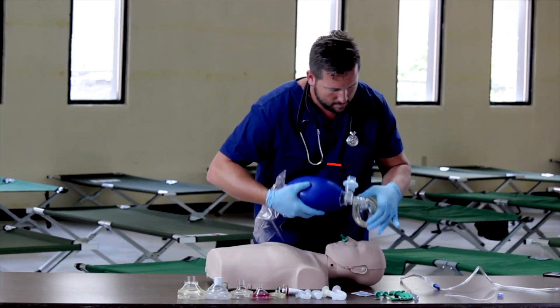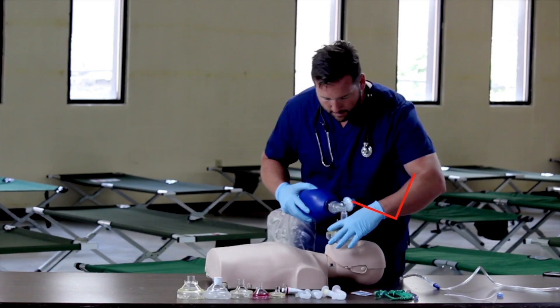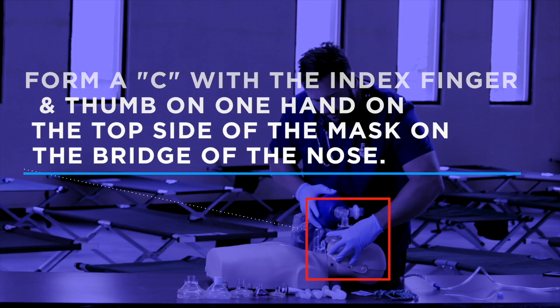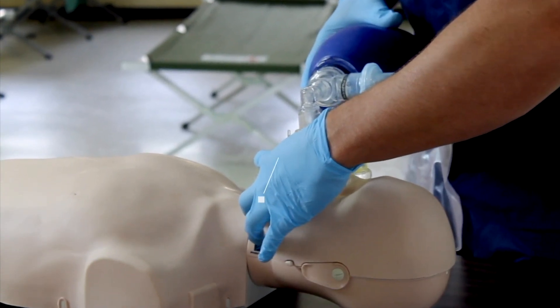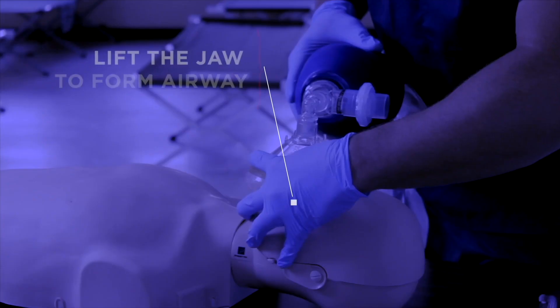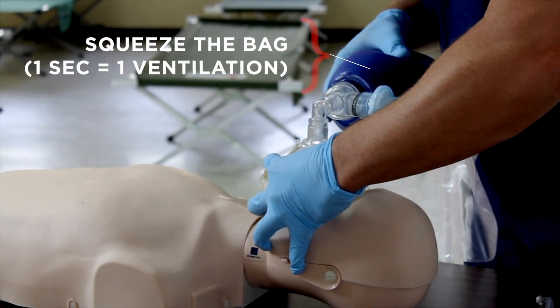Now that we have our airway adjunct in place, we move to bag-mask ventilation. To properly use the bag-mask, use the EC formation with your hands. Form a C with the index finger and thumb on one hand on the top side of the mask on the bridge of the nose — this securely applies the mask to the face. The three remaining fingers form an E and are used to lift the jaw, forming the airway. Maintaining this position, the provider squeezes the bag, taking one second to provide one ventilation.